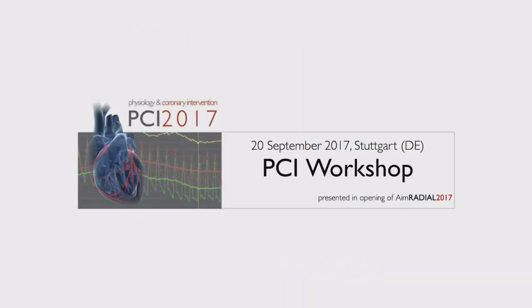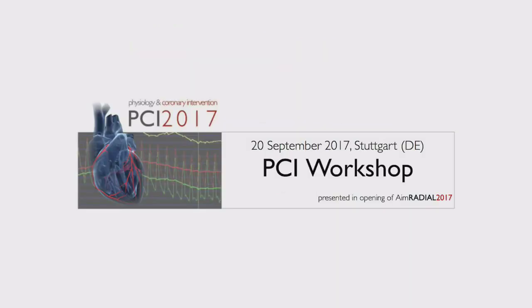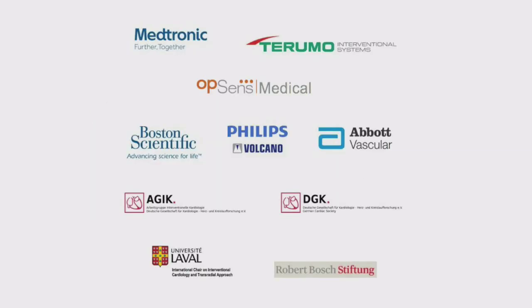that we think that we did a good job and still we have a not perfect FFR. The reason why I always use post-PCI FFR, if it's technically feasible, is because sometimes I find something that I can treat. Maybe a neglected mid-LAD lesion, which looked intermediate, is causing this kind of pressure loss. And this is why I could stent it and arrive at a non-ischemic value. So I'm always aiming at least above 0.80.